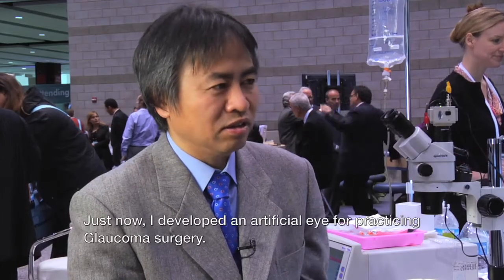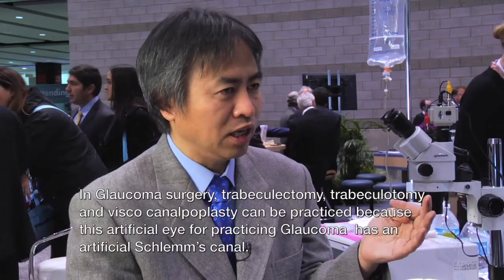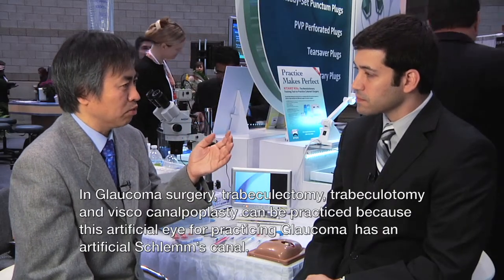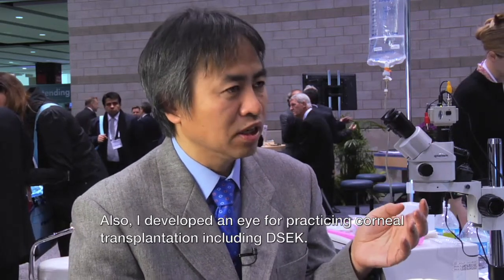Will you be developing new wet labs for different procedures such as DSAEK, glaucoma, or vitreoretinal? Just now, I developed an artificial eye for practicing glaucoma surgery — trabeculectomy, trabeculotomy, and viscocanalostomy can be practiced, because this artificial eye has an actual Schlemm's canal. I also developed an artificial eye for practicing corneal transplantation, including DSAEK. Thank you so much for speaking with us today — it's an excellent product very necessary to help train cataract surgeons.